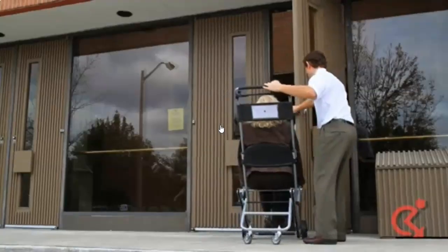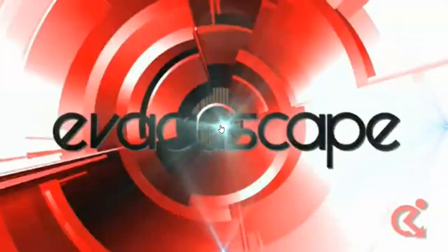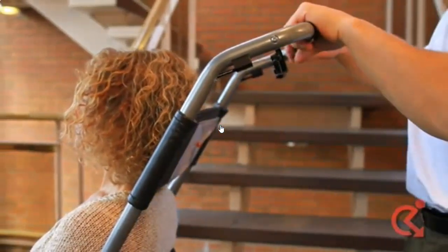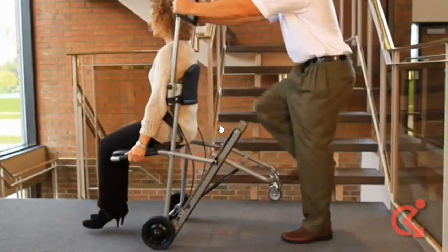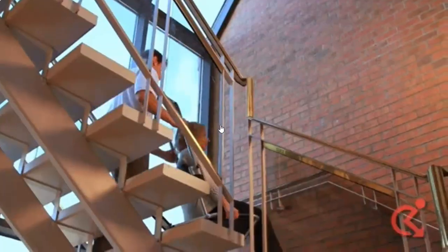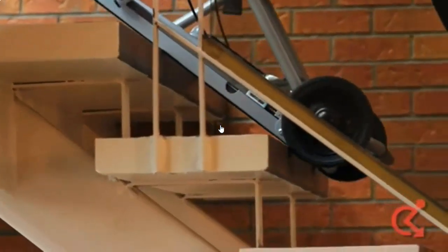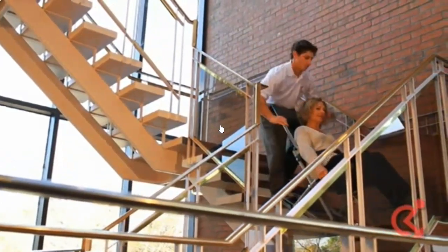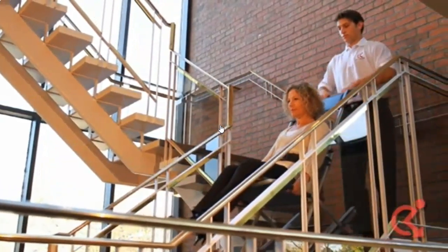The Evacuscape chair is now in transit mode and can travel over flat surfaces smoothly and easily. To change from transit mode to descent mode, change your hand position from top grip to mid grip. Tilt the Evacuscape chair forward until it stops, then push the rear wheels forward until they fold into frame. To descend down the stairs, push the Evacuscape chair confidently over the top two steps so the track grips the edge of the stairs.